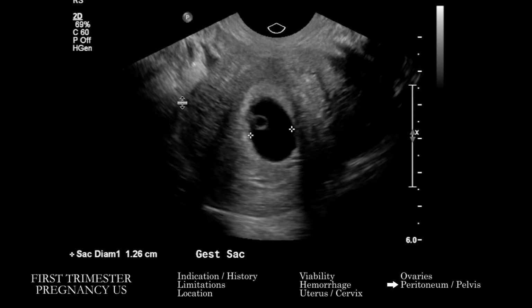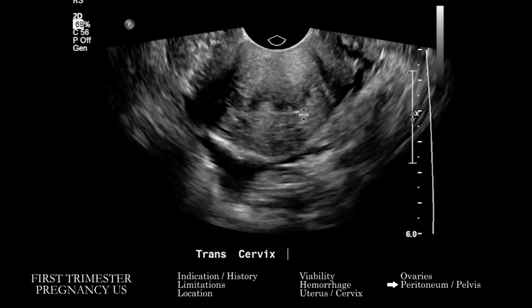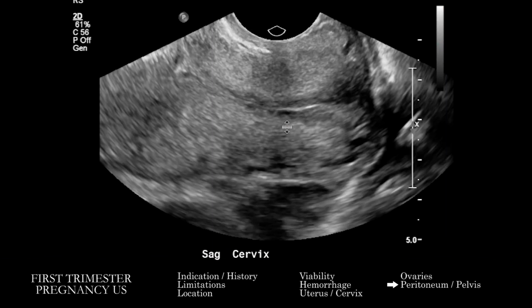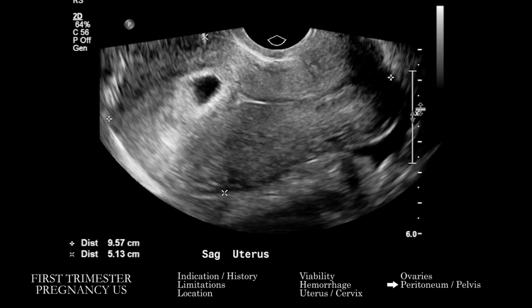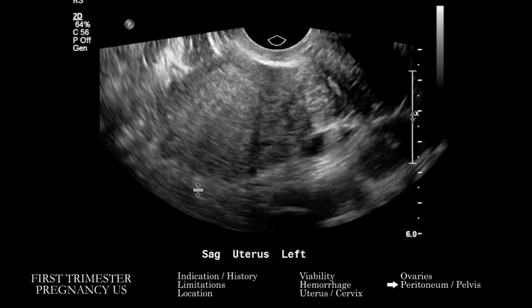Are there other abnormalities, whether obvious mass lesions, free fluid, hemorrhage, etc., in the pelvis, surrounding the uterus, and in Morrison's pouch, looking to see if there's anything here. If we see the bladder, we want to assess that, look for the usual mass lesions, things like that, if we see that incidentally. And then at the end, taking a step back, putting this all in the context of the patient's symptomatology and how far along they are in their pregnancy.